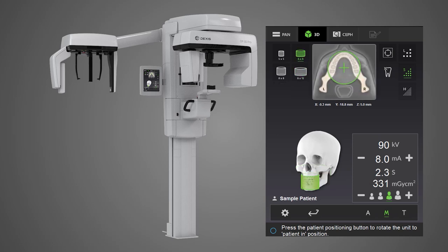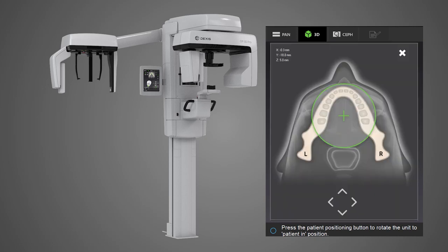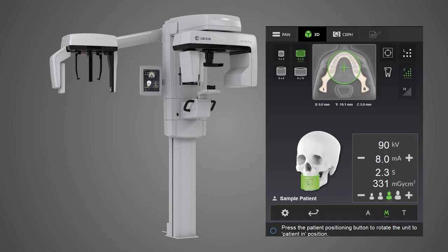On the touch screen, touch anywhere within the displayed dentition. A circle with a crosshair — the field of view cursor — will appear. This circle corresponds to the size of the previously selected scan. Move the FOV cursor to cover the area of interest. For precise adjustments, use the arrow keys.